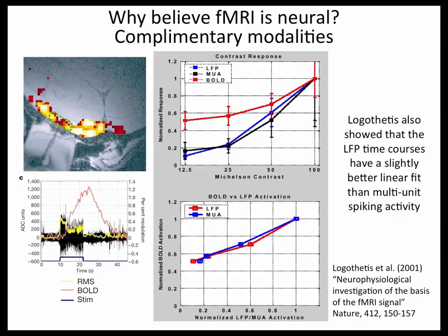The next area of this is complementary modalities. So this is, since BOLD happened, what studies have gained confidence that it works. This was probably one of the turning point studies, headed by Nikos Logothetis back in 2001, where through a real tour de force of engineering, they were simultaneously sticking electrodes into primate brains and recording BOLD at the same time.